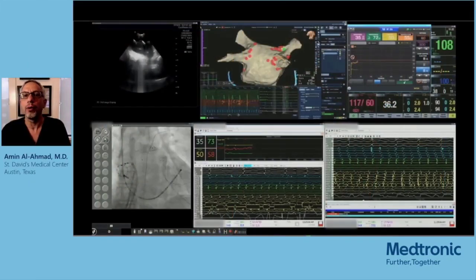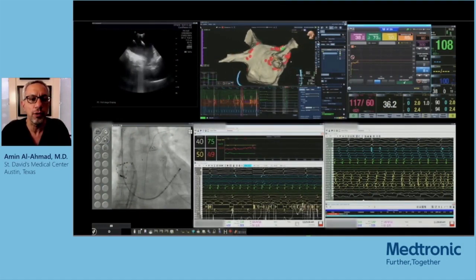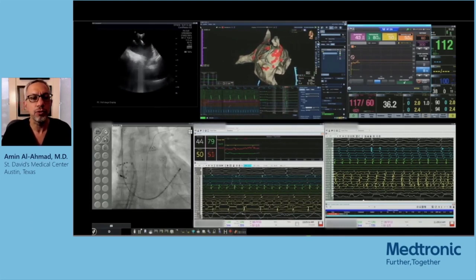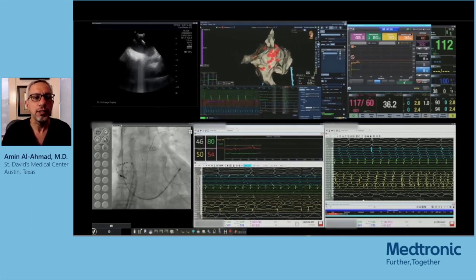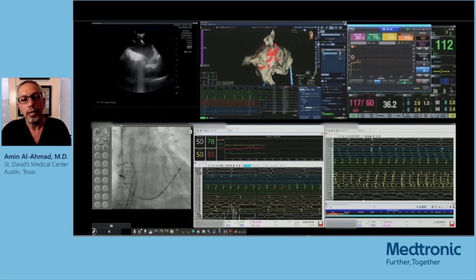Just a couple, again, we set the target temperature, and it'll achieve that temperature for us with varying power. So whatever the power is, it is what it is. You can see the graph here also on the bottom next to my live screen. You can see the temperature that I'm achieving, and the amount of power that's being delivered. And so it's actually pretty easy to understand where I am in terms of contact.